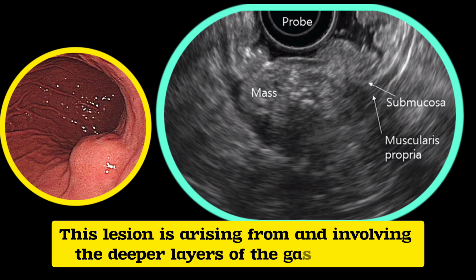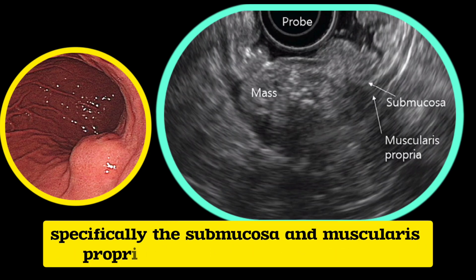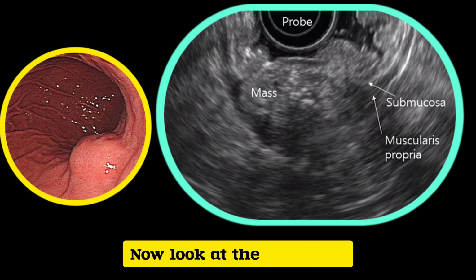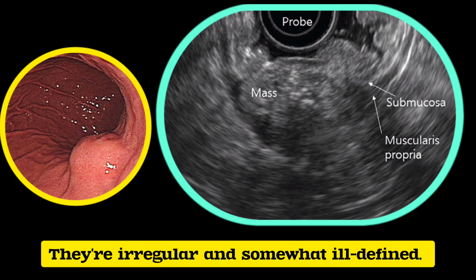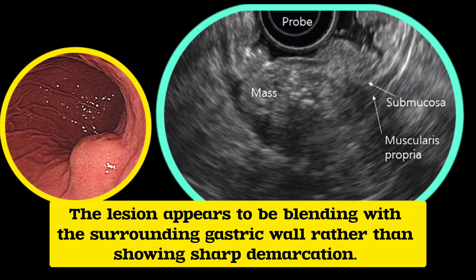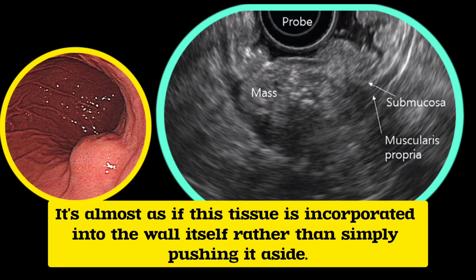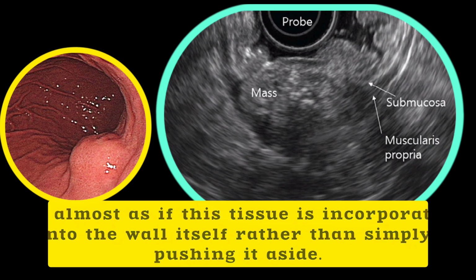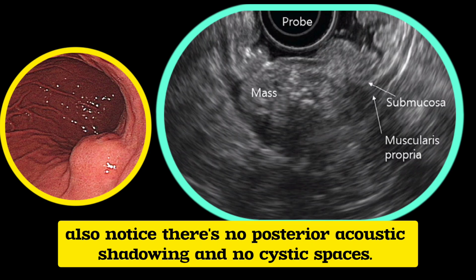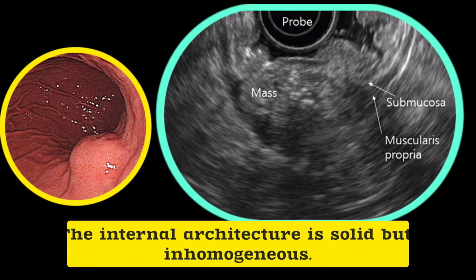This lesion is arising from and involving the deeper layers of the gastric wall, specifically the submucosa and muscularis propria, the third and fourth layers. Now look at the margins. They're irregular and somewhat ill-defined. The lesion appears to be blending with the surrounding gastric wall rather than showing sharp demarcation. It's almost as if this tissue is incorporated into the wall itself rather than simply pushing it aside. Also notice there's no posterior acoustic shadowing and no cystic spaces. The internal architecture is solid but inhomogeneous.